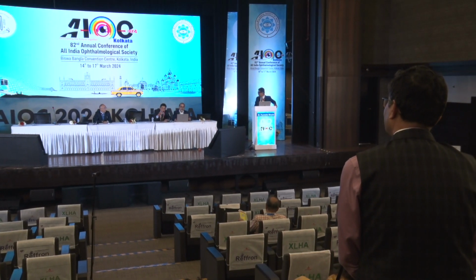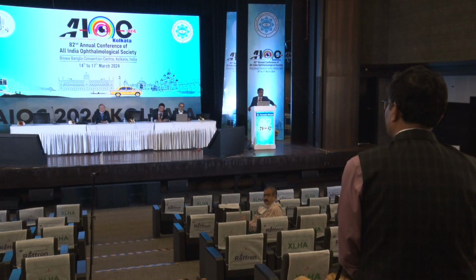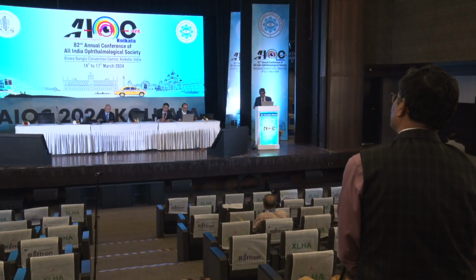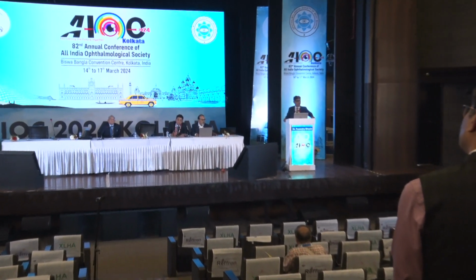You're talking about residual error after a cataract surgery? Yes, sir. Nowadays you have very good Sulcoflex lenses, and lenses are also available from the Indian manufacturers. Those lenses would be much more appropriate because they are 14 millimeter overall diameter, 6.5 millimeter optic. When we had only the Rayner, it was very expensive. Now we have Indian options which can easily be placed.